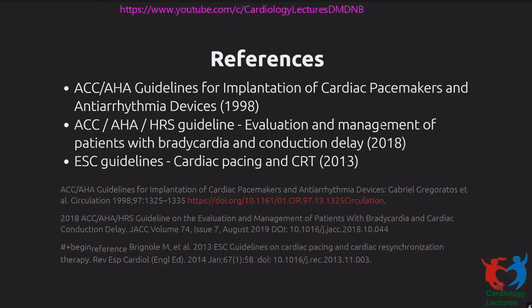Becker syndrome, heart failure, no syncope, EF 25%, LBBB, RBBB, prolonged PR interval, QRS is 130 milliseconds, HV of 110, ICD, HOT-CRT, CRTD. Okay, so it's a complicated question. So basically what you're saying is there's a myopathy and the patient has a reduced ejection fraction with heart failure.